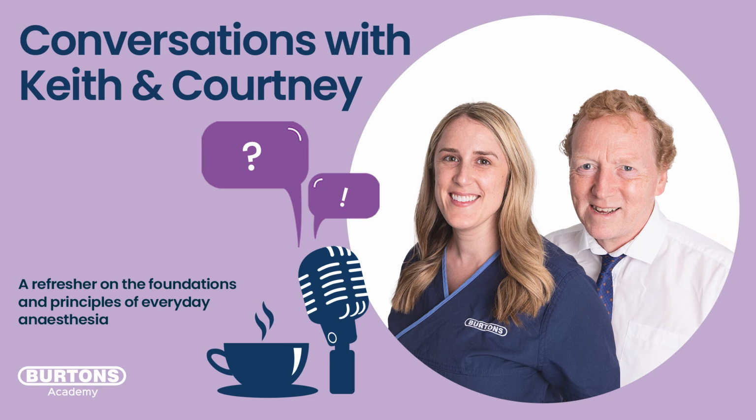Exactly. Whenever you look at an odd value, you go back to your production, your cardiac output, and your elimination, and you work out very quickly what might be going on. You zone in on elimination, and you look at the capnogram itself and say, actually, that looks perfectly normal. Everything's spot on. This is purely a hyperventilating animal. If it doesn't look normal and you've got molehills, then we've got something else going on. We're not sampling properly. We maybe have a big leak. We need to attend to it. It was okay, now it's not, so something really has changed.